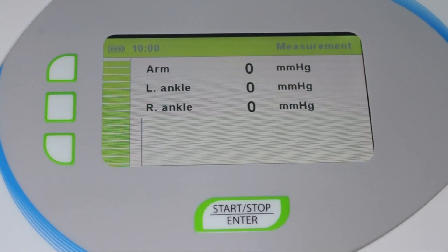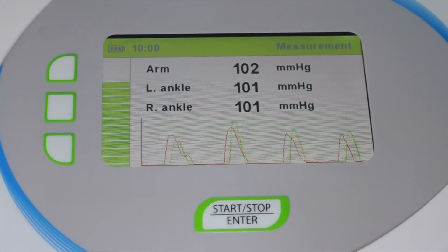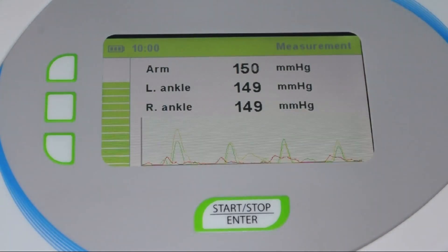Press the start button to start the ankle brachial index measurement. During the measurement, current blood pressure and pulse wave are displayed. The maximum pressure in the cuffs is calculated during the inflation and therefore varies from person to person.